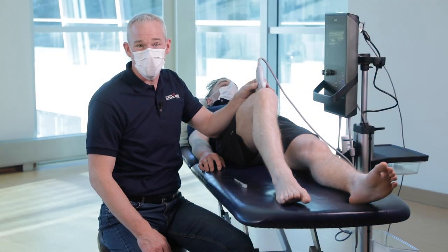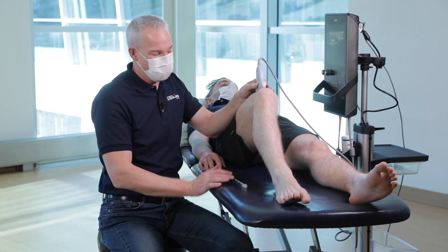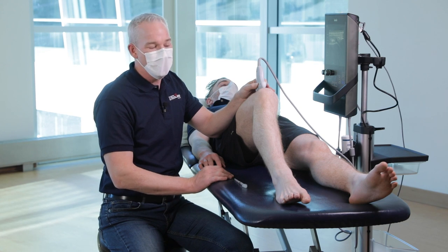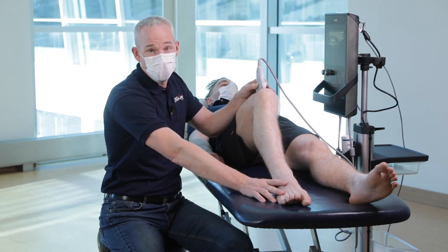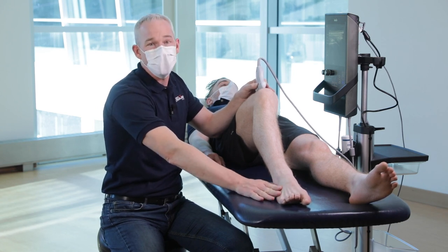I'm going to show you how to scan and inject the knee joint using ultrasound. I've already got my patient positioned at a perfect angle, approximately 30 to 40 degrees of flexion. You might need a large bolster, and you definitely need a non-sock wearing foot so it doesn't slide on the exam table.